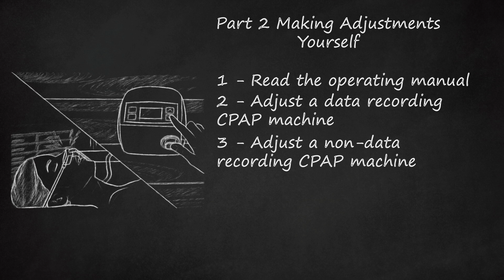If you don't feel rested upon waking, or if your partner informs you of your sleep apnea, snoring, or gasping, then you'll likely want to increase the pressure settings. To change the settings on a non-data recording Respironics CPAP machine, follow the instructions above on how to change them on a data recording machine. The main difference is that you won't be able to access the data option beforehand to see your AHI.